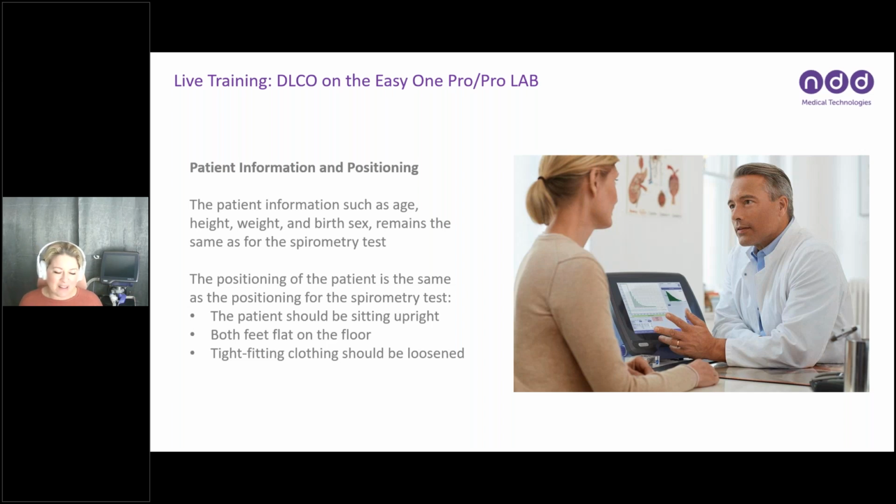Another question we get a lot, which I don't have included on the slide, is about dentures. Same as for spirometry, for any test. If the dentures are well fitted and secured, by all means leave them in place. The patient is going to be able to make a much better seal on their mouthpiece with those left in place. Obviously, if they do not fit correctly, too big, too small, not well secured, the patient would probably have a better time taking those out.